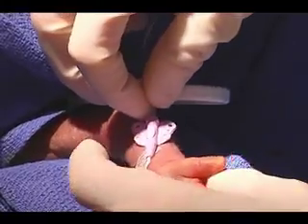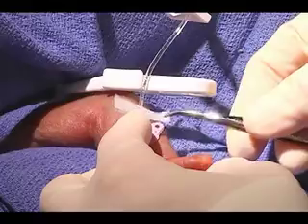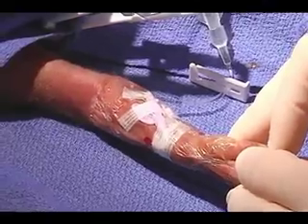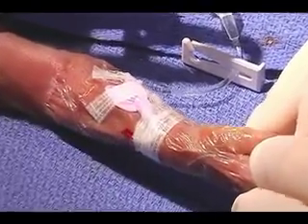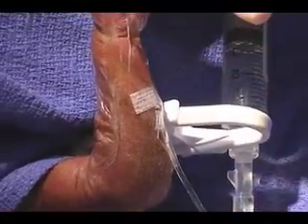After correct placement has been verified, stabilize the catheter with adhesive skin closure strips and cover with a sterile, clear, occlusive dressing. Maintain visibility of the insertion site, coiling any unused catheter away from the insertion site. Do not encircle the extremity with the dressing. Place a sterile catheter cap on the end of the catheter. You may now connect new intravenous fluids and new tubing to the neonatal PICC.